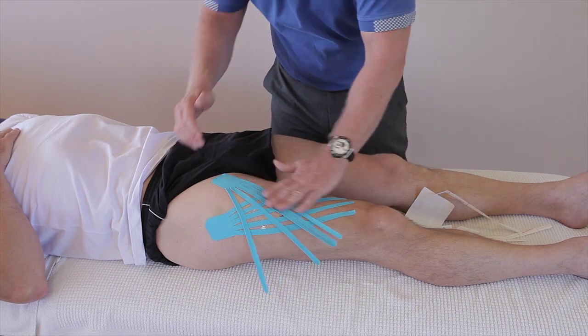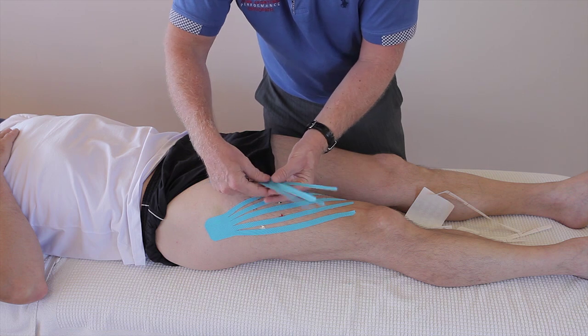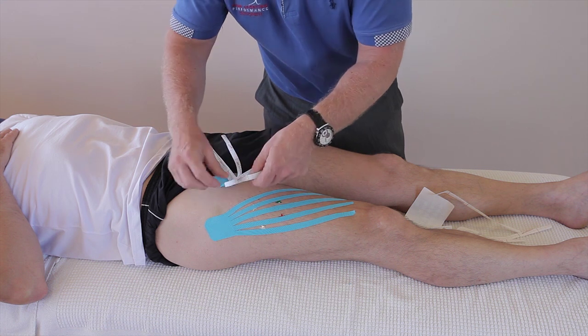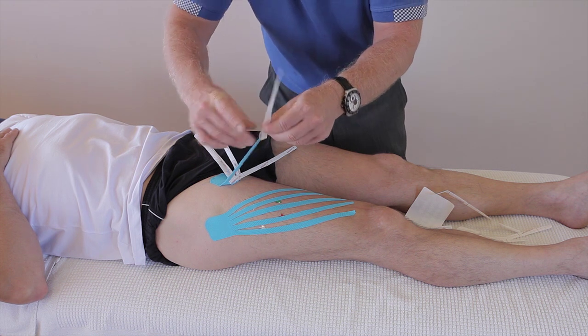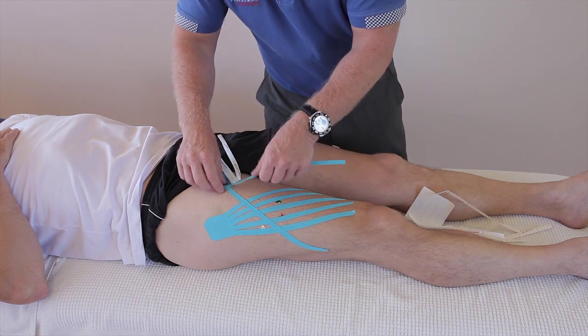Now for the second tape — that's going to be lateral and this one is going to be more medial. Again, move the four fingers out of the way. Peel that one back, and then literally just cross that area where it's all swollen.